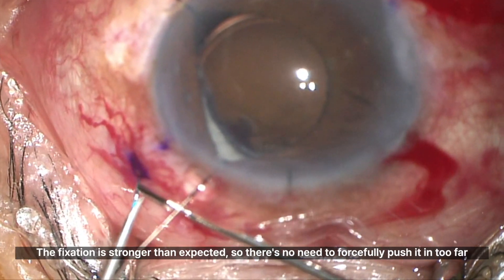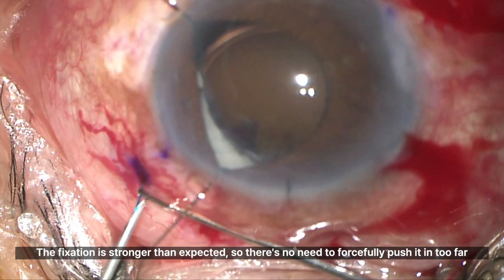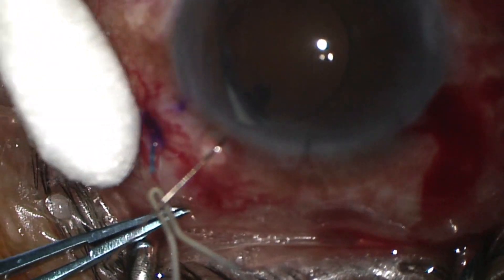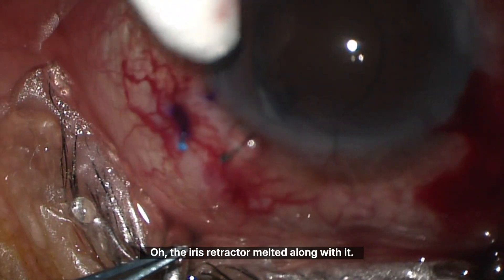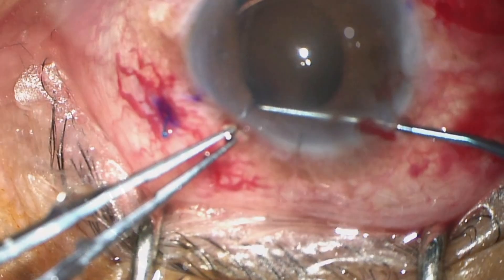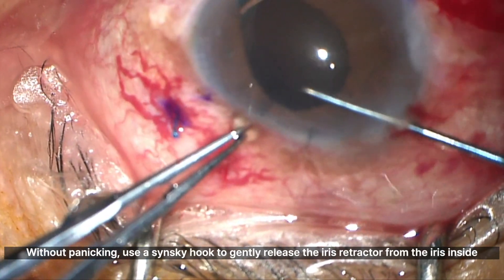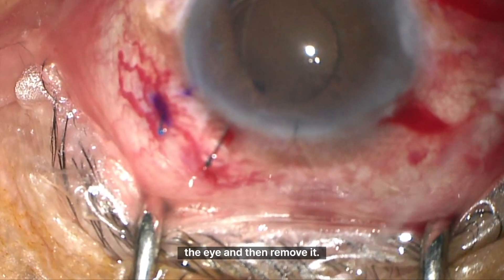It's sufficient to insert the haptic slightly into the needle — the fixation is stronger than expected, so there's no need to forcefully push it in too far. The iris retractor melted along with it; it seems much more heat sensitive than prolene. I'll need to be more careful next time. Without panicking, use a Sinski hook to gently release the iris retractor from the iris inside the eye and then remove it.